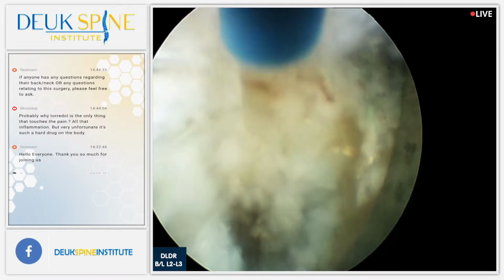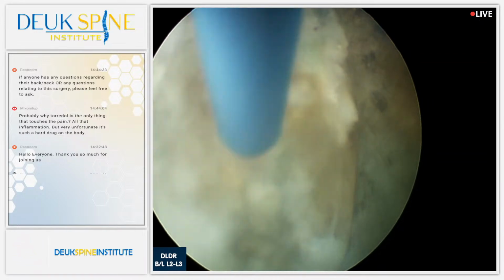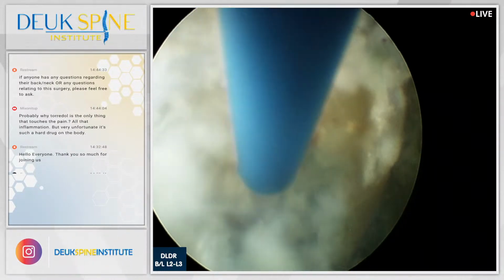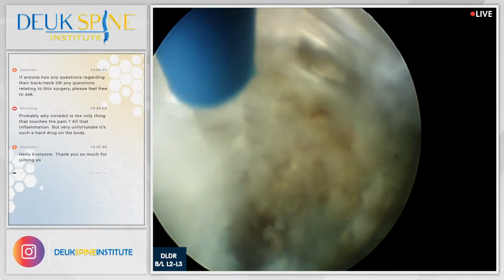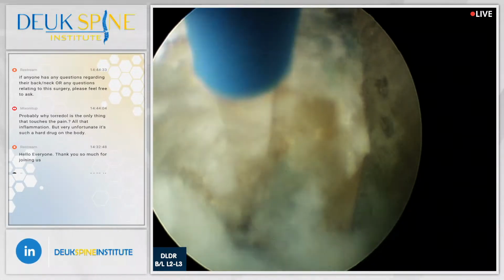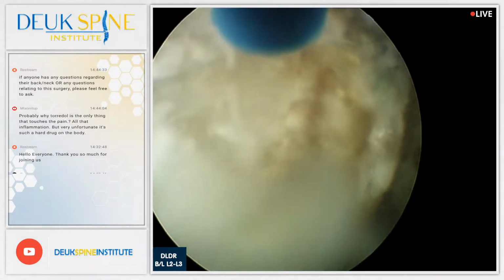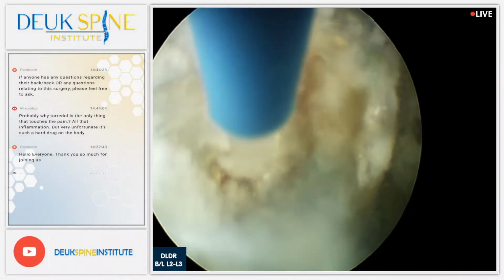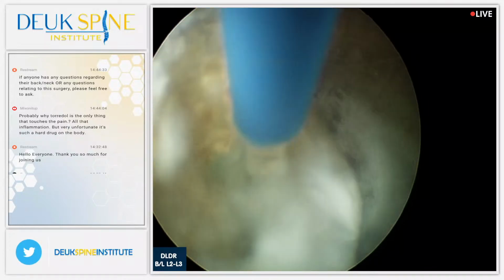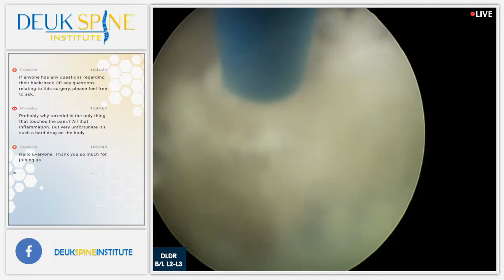All right, we are at the outside of the tear. We are just about finished. This is the most painful part of the surgery, this outer part of the tear. Guys, is the next patient here ready to go? You can actually see the gold color is calcium, shouldn't be there. Comes with chronic inflammation called dystrophic calcification. The blue fiber is the laser fiber. It's the plastic cover around it. This is the lateral part of the herniation.